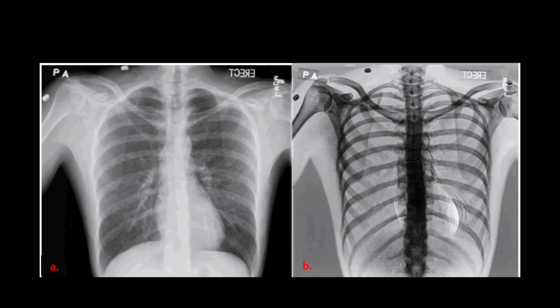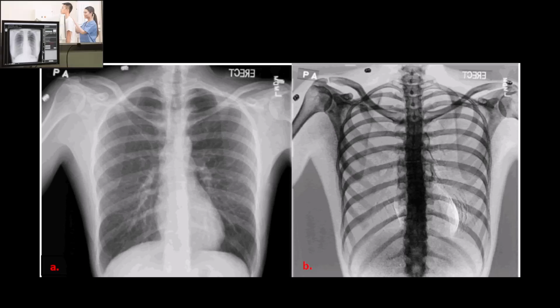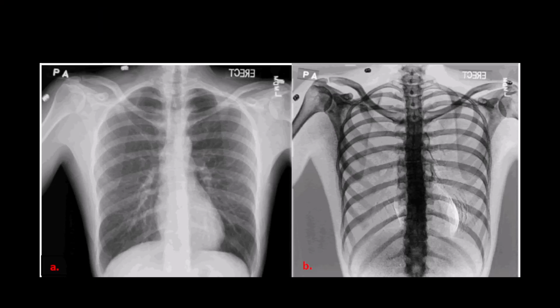The data from that interaction was utilized by doing an analog to digital conversion, which is taking the energy and converting it into numbers, and then taking those numbers, or the data, and reversing the process and converting the data into energy, or visible light, that's displayed on our monitor.